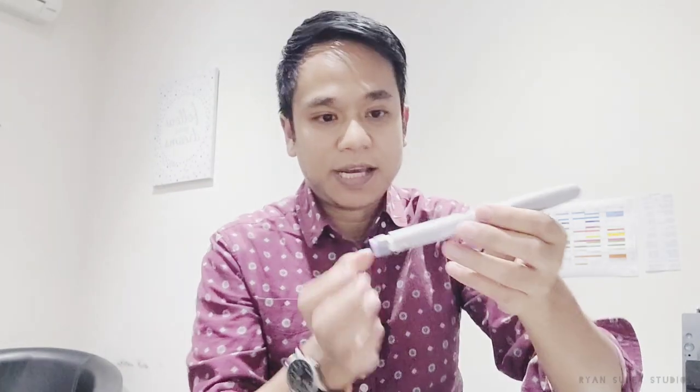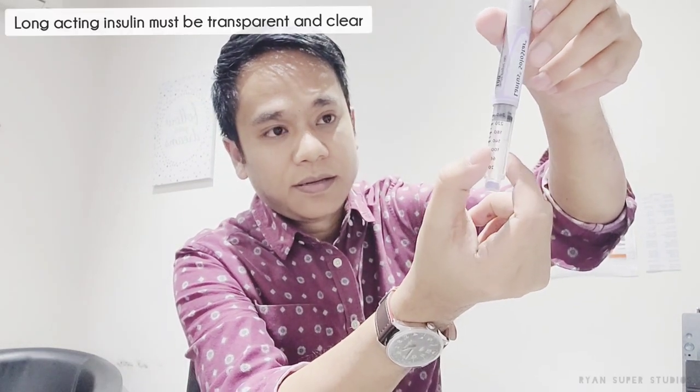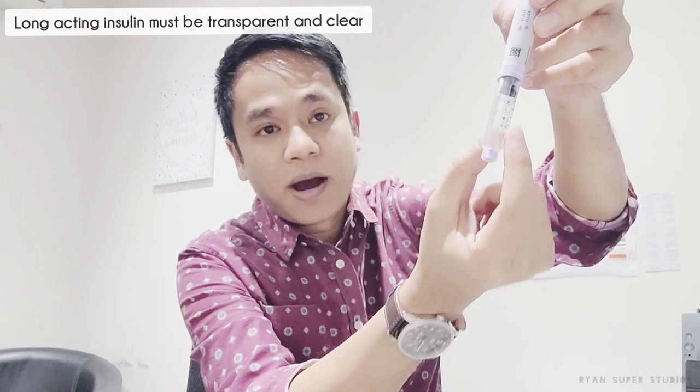Remove the cap — that's the insulin there. It's transparent, so you need to make sure the insulin is actually transparent and clear. You shouldn't be seeing any particles floating in it; it should be completely clear and transparent.